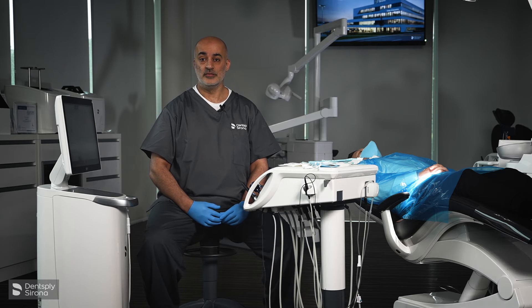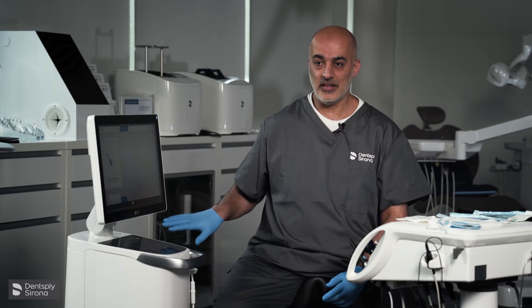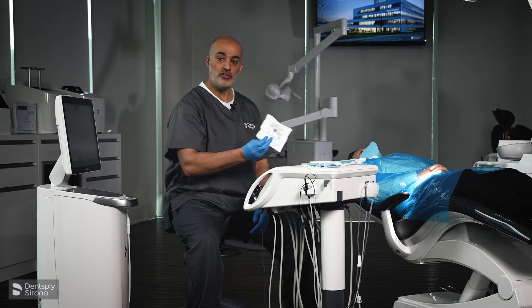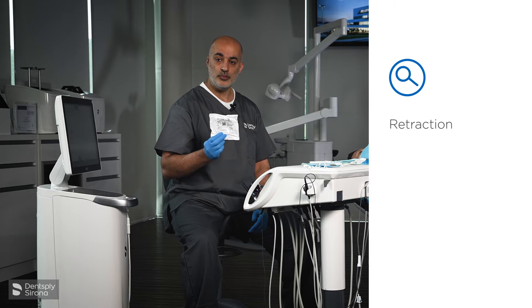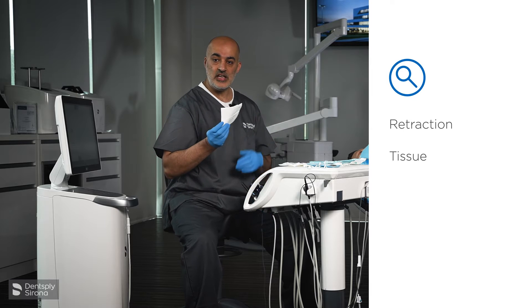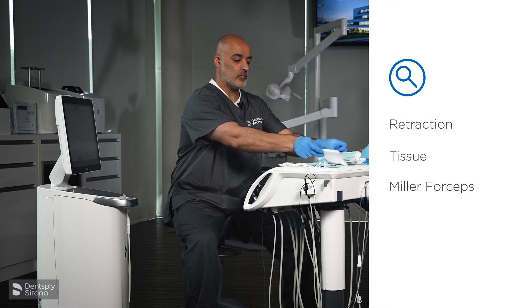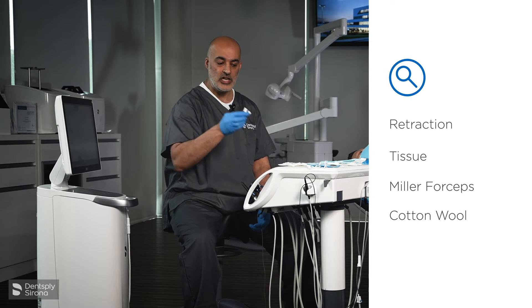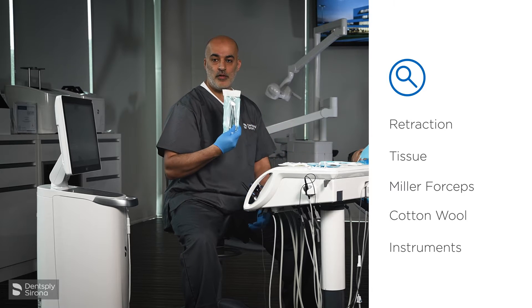We are now on to scanning the patient. We have disinfected the screen, the trackpad and the camera, and we're now preparing the patient for scanning. There are some tools we need to make sure we consistently scan the patient. We use an OptaGate to hold the tissues out of the way, tissue to dry the teeth which are held with Miller's forceps. You can use cotton wool rolls, again used to keep the tongue or the cheek out of the way, and the standard mirror probe and tweezers pack.